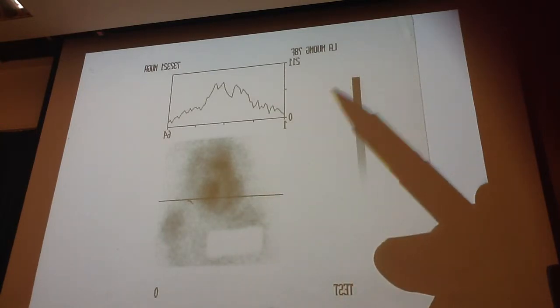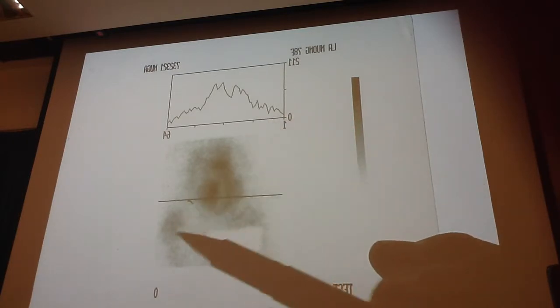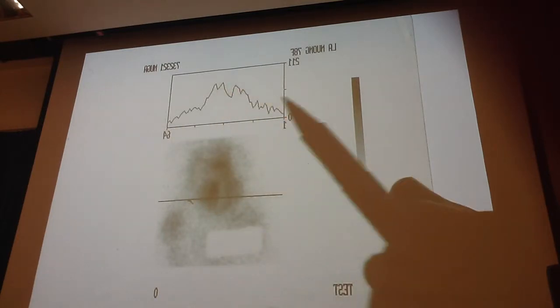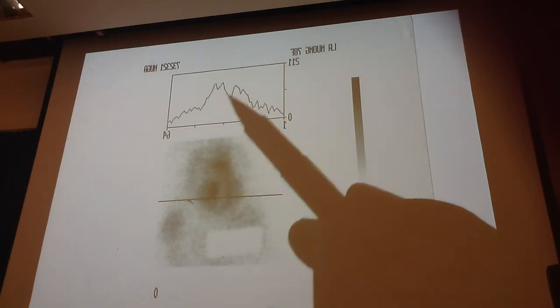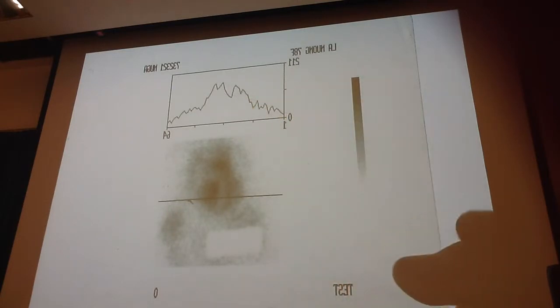You have to think, for X-ray, nuclear, MRI, CT, we have to convert the patient's three-dimensional information into a series of frequencies that go to our computer. So what you're seeing here, okay, so here's the right ventricle, here's the septum, here's the left ventricle, and then all this is just background. Makes sense?